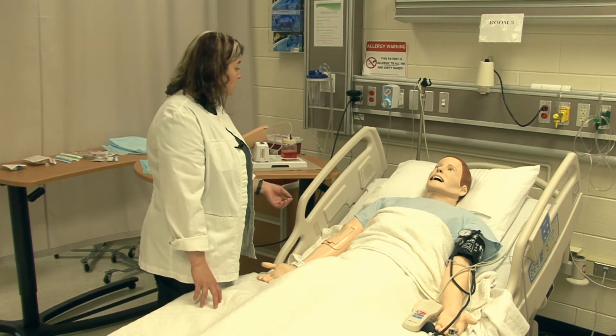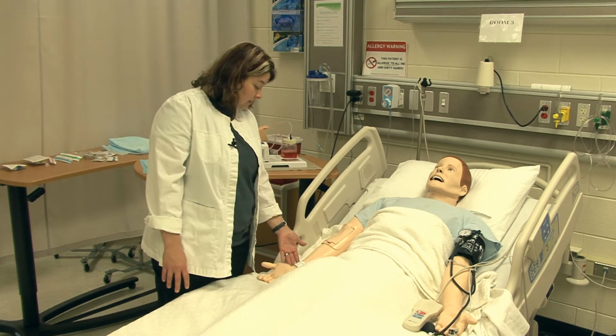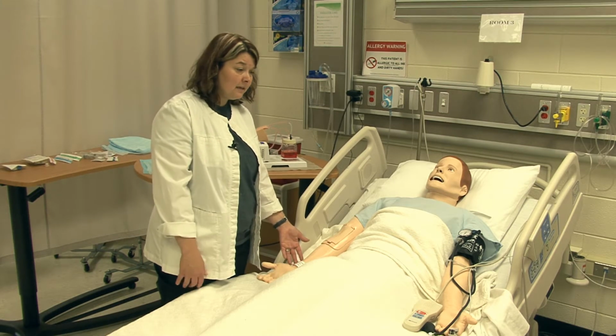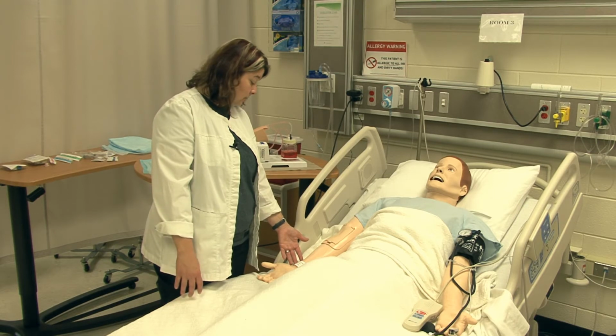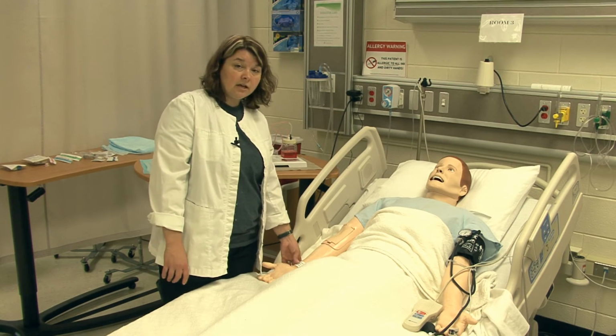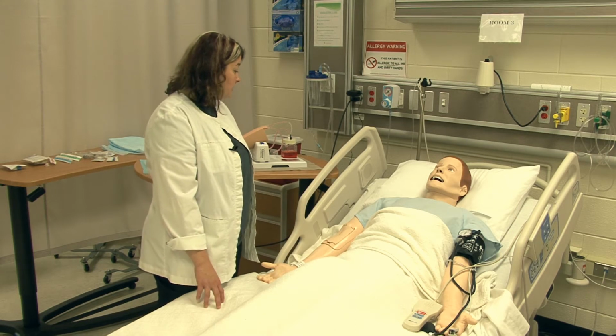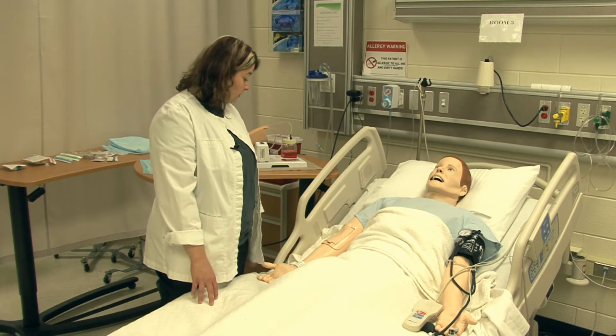Mr. Smith, can you please tell me your name and date of birth? And as he's doing this, I'm going to look down at his armband and confirm that he indeed is Mr. Smith and that his date of birth matches. And I'm also going to check it again for the allergies. So we've acknowledged, we've introduced, we've explained the duration and the explanation of the procedure.